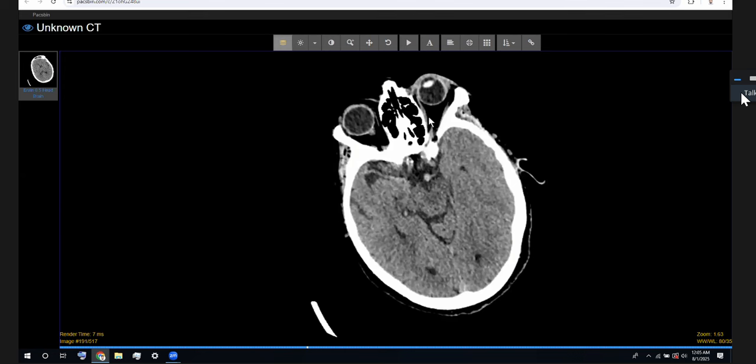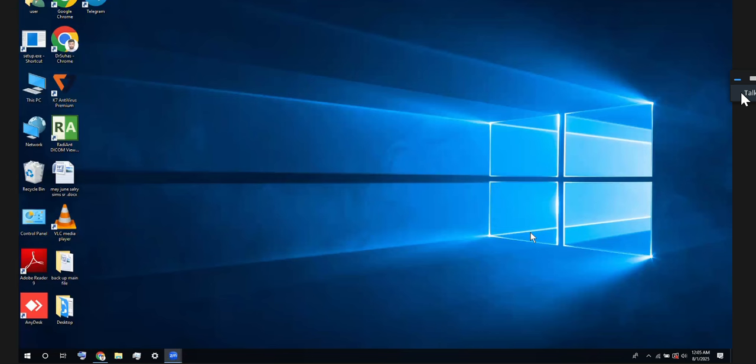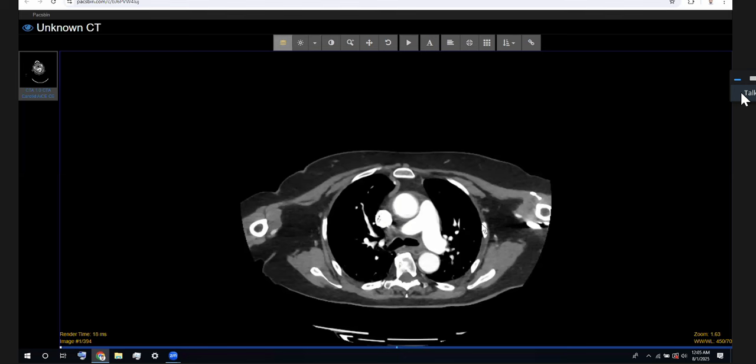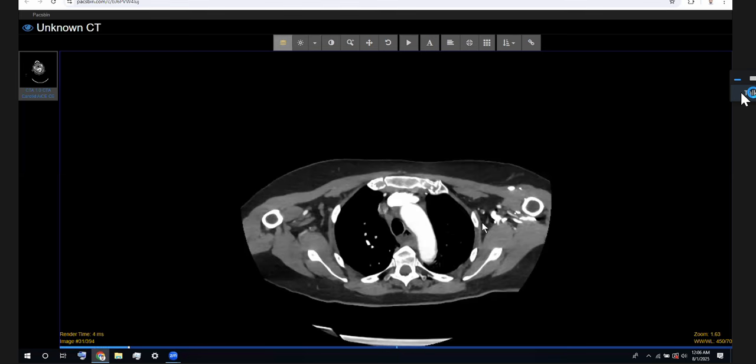I've just posted the CTA there, which confirms it, if you want to take a look at that as well. I like that you're saying you'll pick up the phone and say this is an urgent finding. That's exactly what they want to hear. You do understand the gravity of the situation and that you need to act fast.